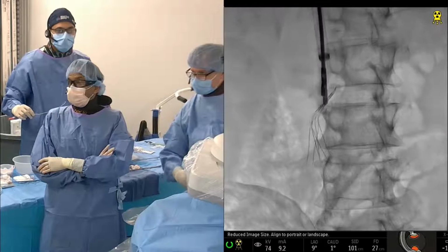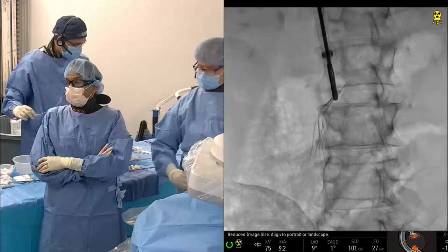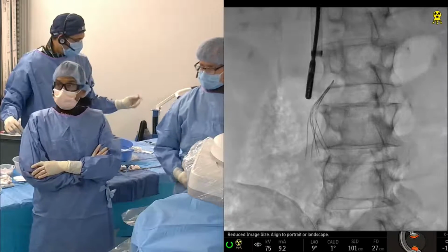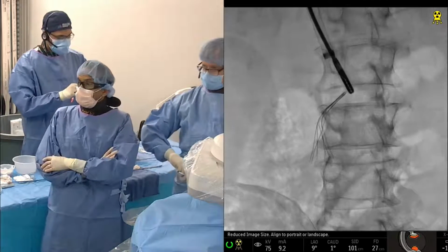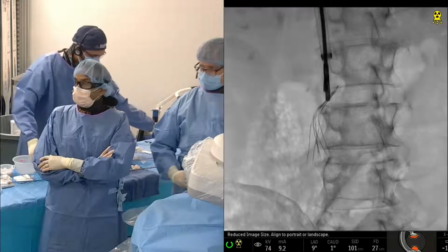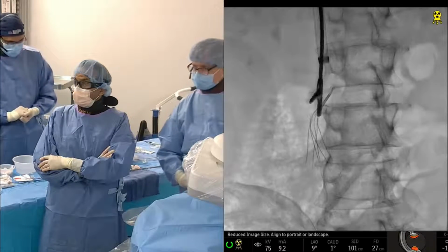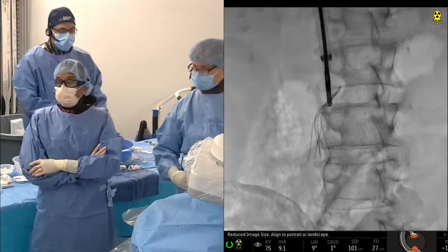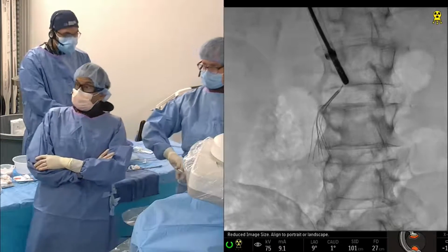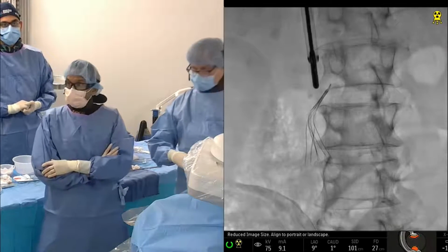I think it provides me, probably falsely, a little bit more comfort if I'm doing an inversion. I know I have single cut nitinol, and it makes me feel a little bit better. There's no doubt that coming from below and just inverting it might even be viewed as being easier. And again, I'm still just next to it. Coming from below, you come right up into the apex. Yeah, exactly.